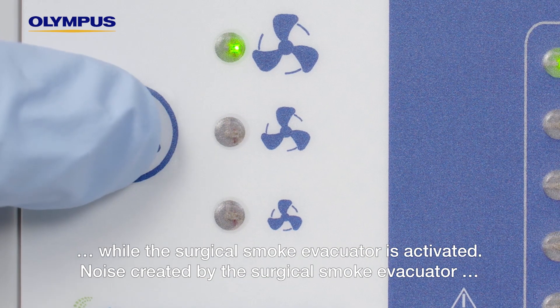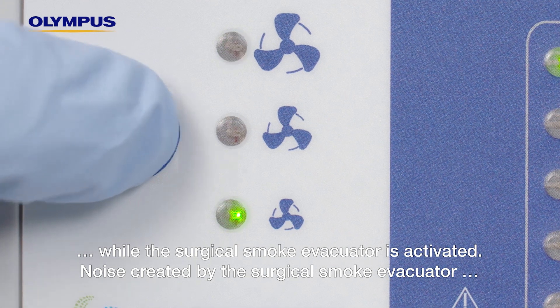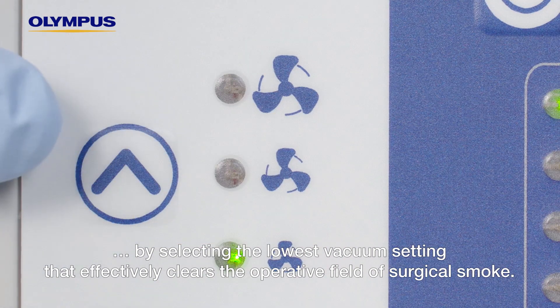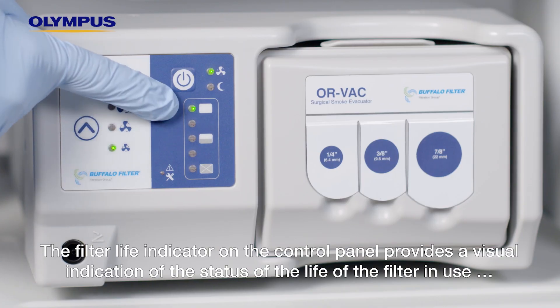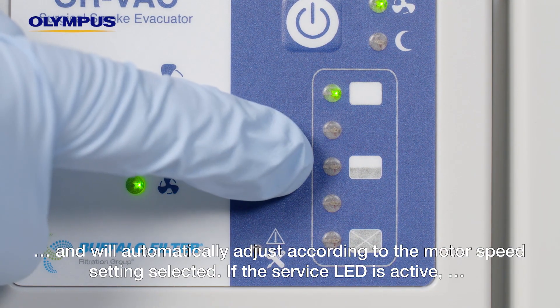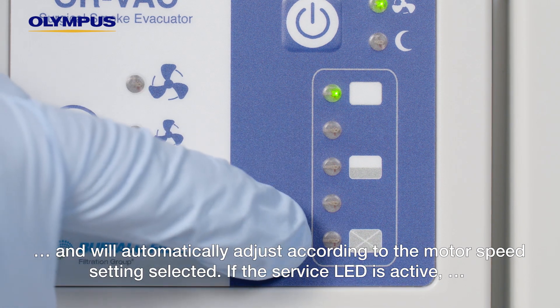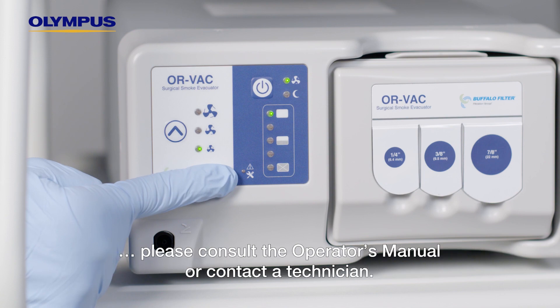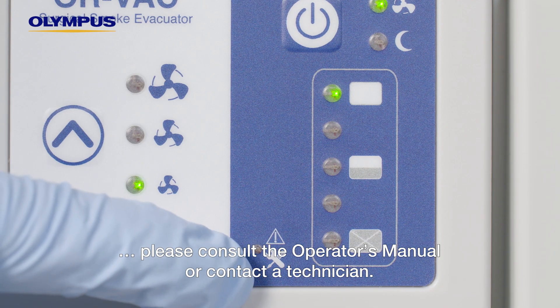Noise created by the surgical smoke evacuator can be minimized by selecting the lowest vacuum setting that effectively clears the operative field of surgical smoke. The filter life indicator on the control panel provides a visual indication of the status of the filter in use and will automatically adjust according to the motor speed setting selected. If the service LED is active, please consult the operator's manual or contact a technician.